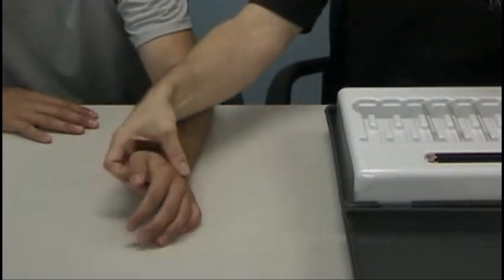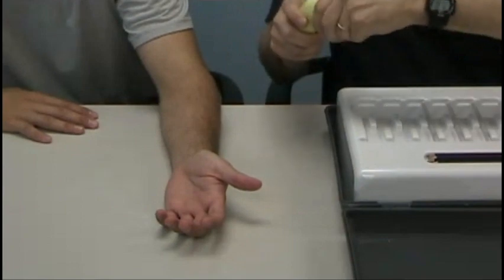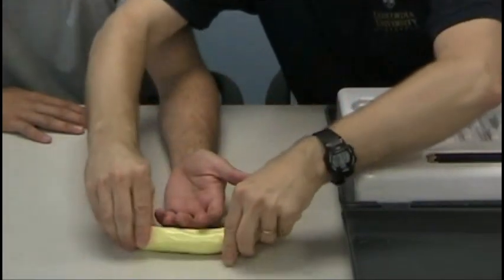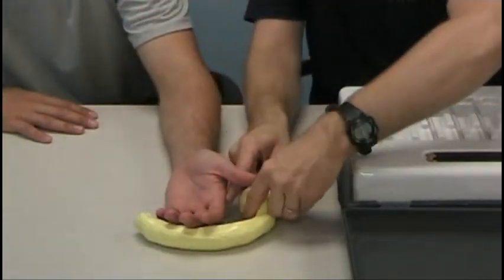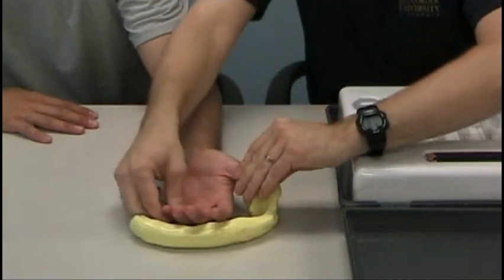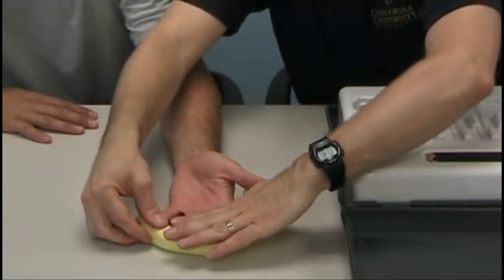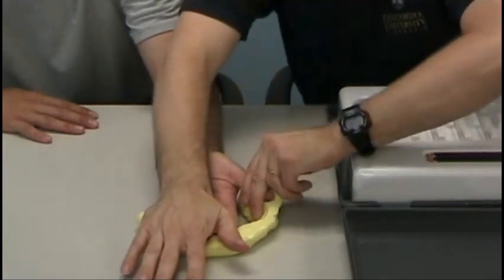The patient is positioned at a table with palm up. The fingers need to be supported, preferably on a big lump of therapy putty like we have here. You're going to position their fingertips and thumb so that the tips are embedded in the putty, and the putty holds them in place.